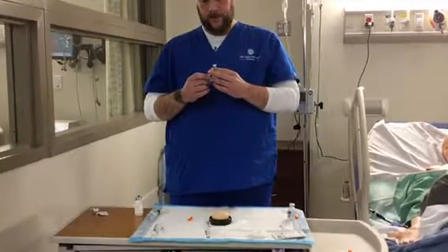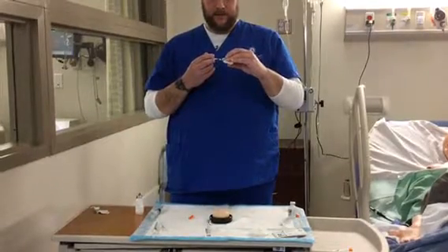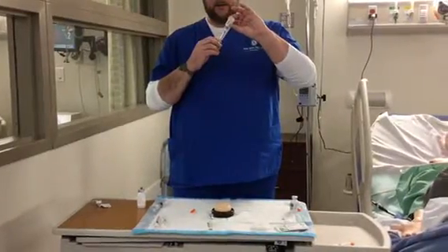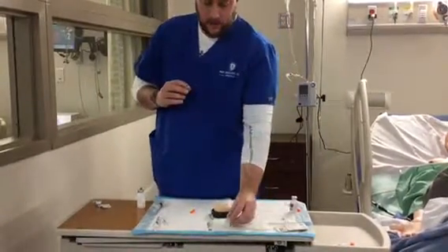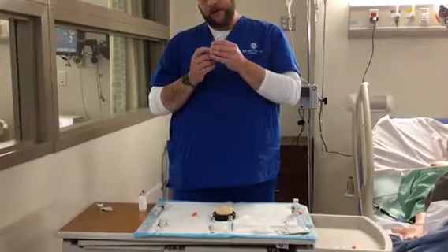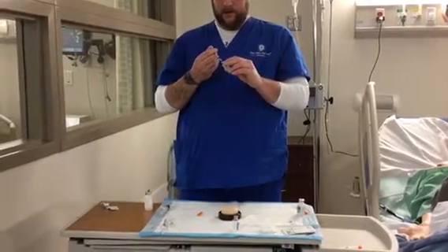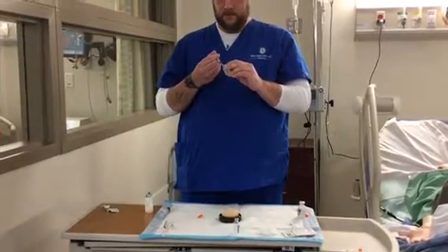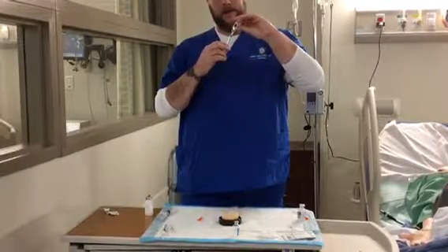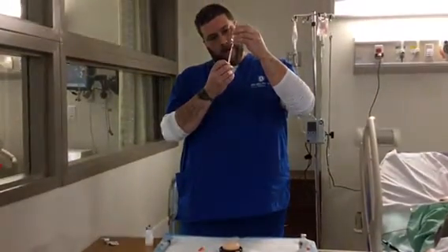So I want to withdraw 10 of air, insert into the vial, and put 10 into the cloudy. Next I'm going to grab the clear, since that's the first one I'm going to be administering. I want 10 units of air. Insert into the vial. Be careful not to bend the needle. Insert 10 of air. Now while I have this out, I'm going to withdraw the 10 of the clear.